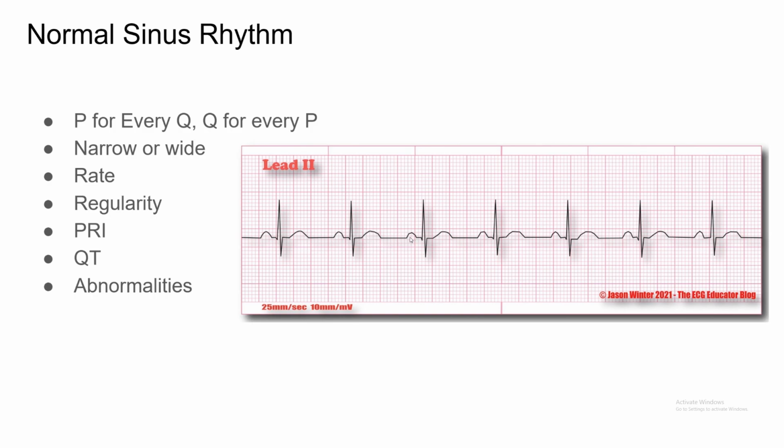But I know this really tripped me up when I was first reading EKGs, and it still trips up a lot of people in general. And actually, doctors argue about the significance of what I'm about to talk about right here. So remember how I said that this is the J point, right? Sometimes you can have just an elevated J point. So this segment right here, part of the ST segment, this J point, let's say it's up here, right? You have J point elevation, right? But that's not true ST segment elevation because it's going down. And it's going down, and the J point's just elevated, not the whole segment, right?